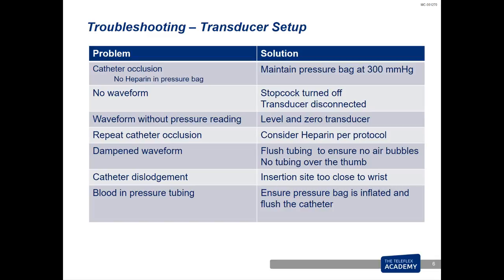The other thing I want you to think about is if your catheters dwell for a long period of time, do you use saline in your pressure transducer or do you use heparinized saline? In pediatric practice, we continue to use heparinized saline to ensure catheter patency, but in the adult world, we have moved away from heparinized saline and really have moved to saline only. There are published studies that do show that heparin is an advantage when using a transducer on an arterial catheter for a long period of time.